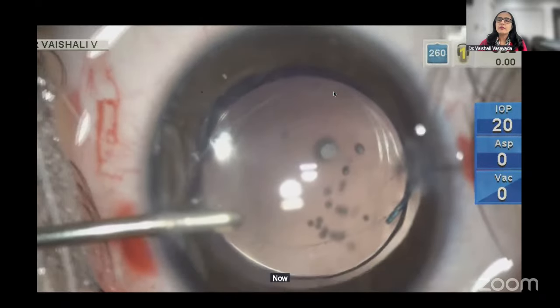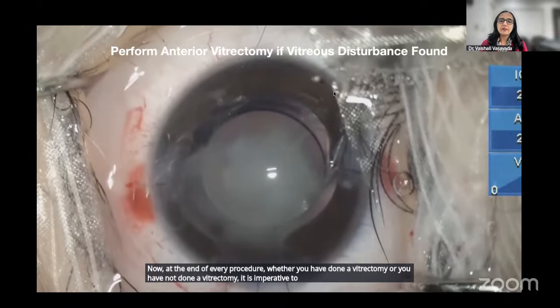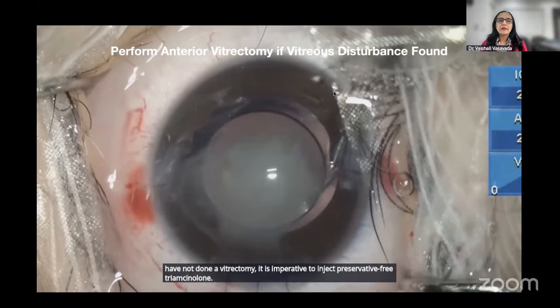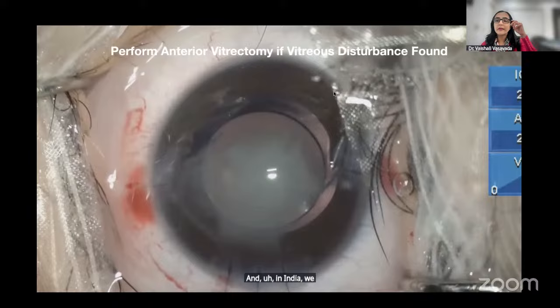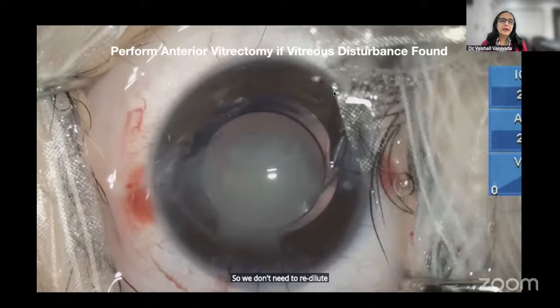Now, at the end of every procedure, whether you have done a vitrectomy or you have not done a vitrectomy, it is imperative to inject preservative-free triamcinolone. And in India, we are lucky we have several brands that give us preservative-free triamcinolone. So we don't need to dilute or anything. And this is injected in the anterior chamber.